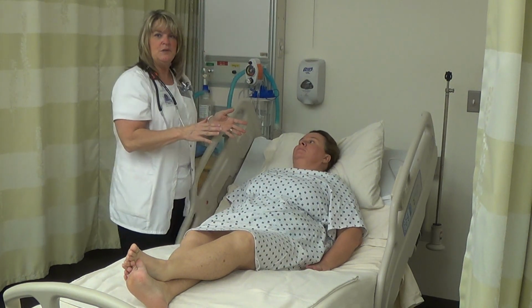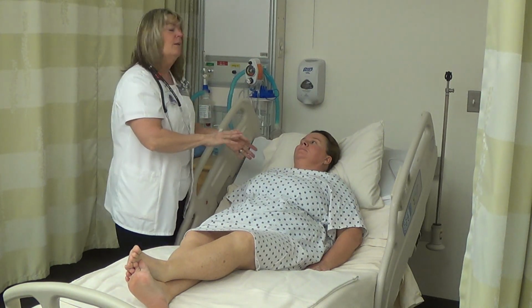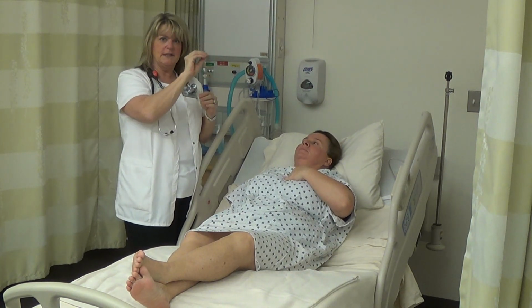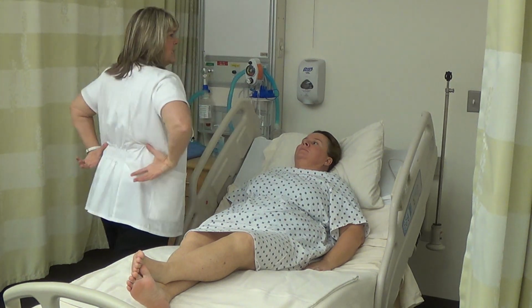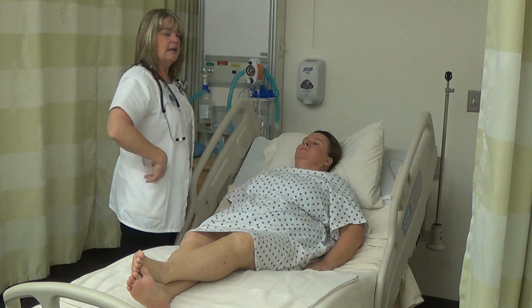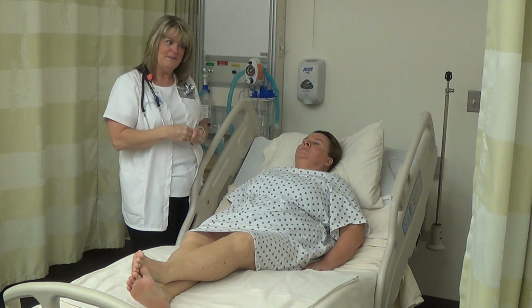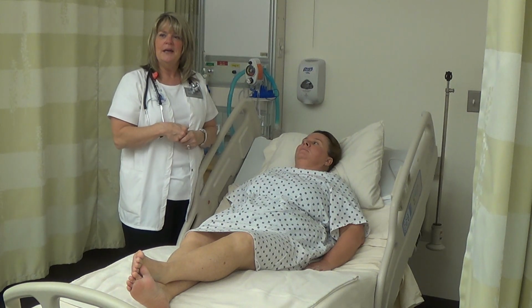Now, what we would do next is we would listen to her lung sounds in the back. I'm not going to have her sit up, but we would do the exact same thing. We're going to start at the very top, above the scapula, and then work your way across and down, across and down, across and down, all the way down to the bases, which are going to be just about above the kidneys. So again, take your time and go slow, and take a look at your textbook to make sure that you're hitting all of those spots. All right? So we're done with the chest. Now we're going to move on to the abdomen.